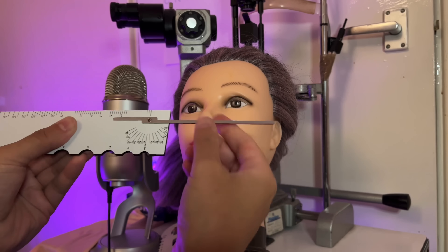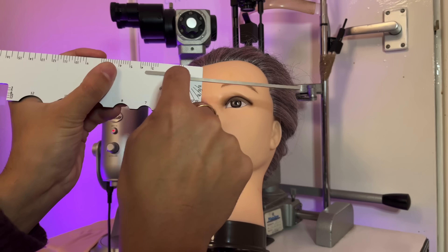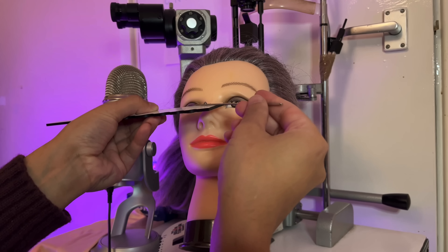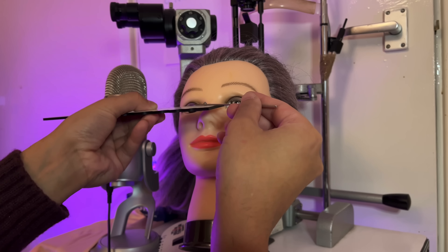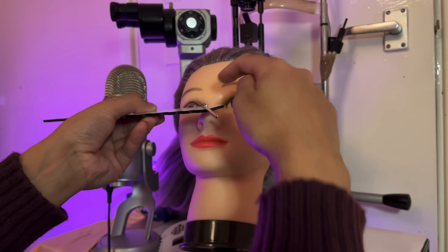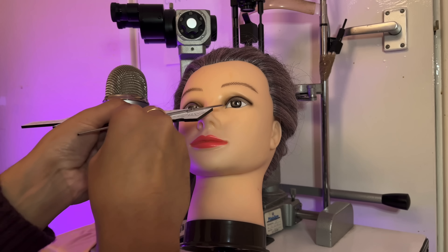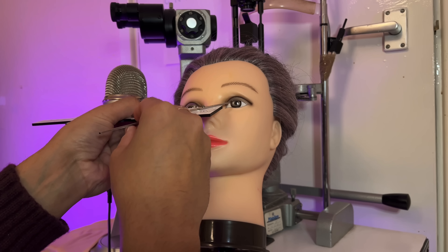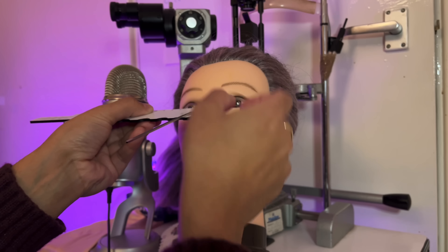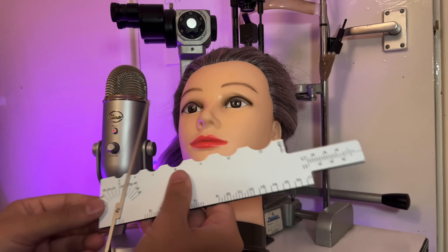For the splay angle I'm going to continue with this here — place this line in the center of the nose again. Just be aware you don't want this part to poke the patient in the eye, so make sure you're missing the eye. Contact is made here and we read off the scale. For the opposing side, again missing the eyeball — the patient can close their eyes if they wish — contact is made and we read off the scale. Marvellous.